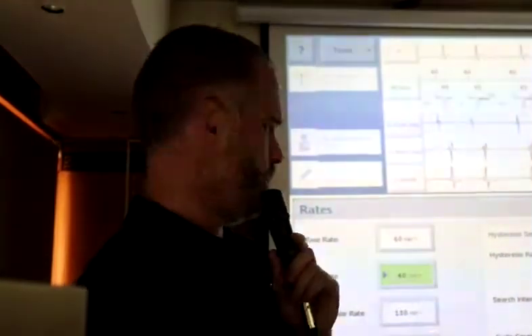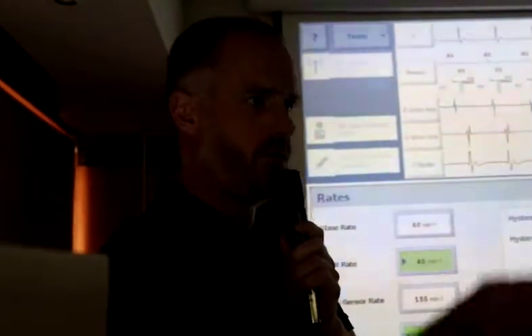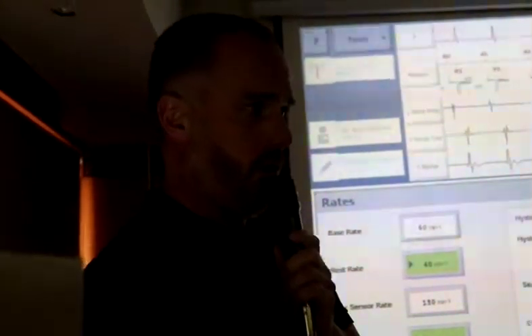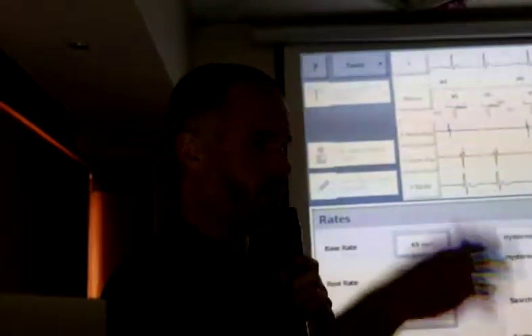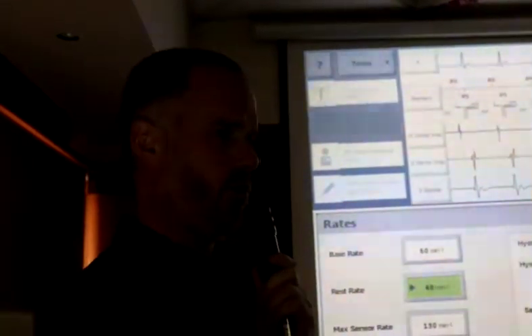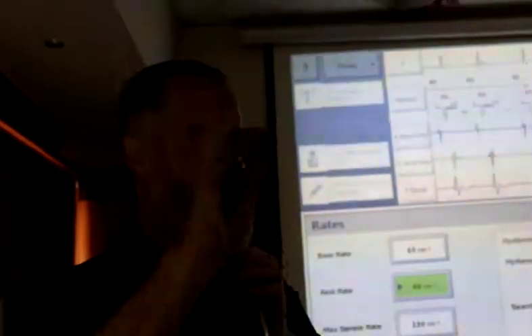And it was pretty straightforward. I put this to 190. She has no other complications. 190 beats per minute. And we put her on a treadmill, and she did the Bruce protocol. She did 15 minutes on the Bruce protocol. She was running on the treadmill, looking at us, saying, "What have you done?" I think she thought I was some kind of being from outer space.